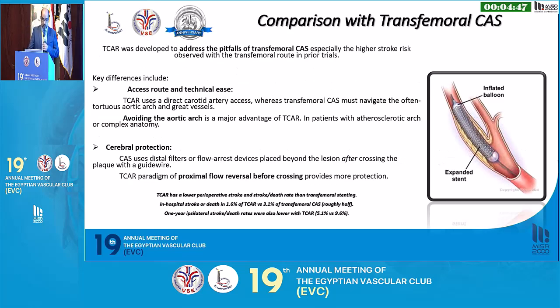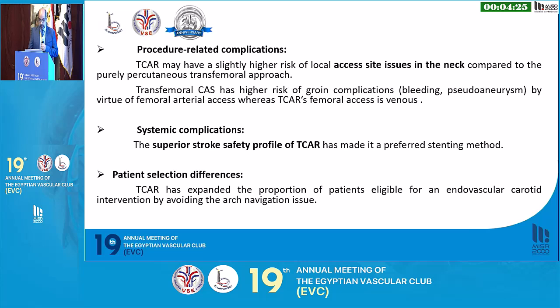About the comparison between the TCAR and the usual carotid artery stent, we found that it addressed the pitfalls of the carotid artery stenting. About the access route, TCAR is a minimally invasive access route, avoiding the aortic arch manipulation, and it has a cerebral protection device by the proximal flow reversal system. And about the procedural complications, the TCAR may have a higher risk of local site complications at the neck, compared with the transfemoral groin complications such as bleeding and pseudoaneurysm. And about the systemic complication, the superior stroke safety profile of the TCAR made it preferred among stenting methods.